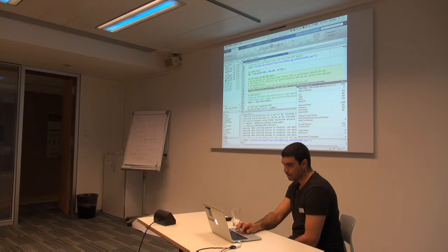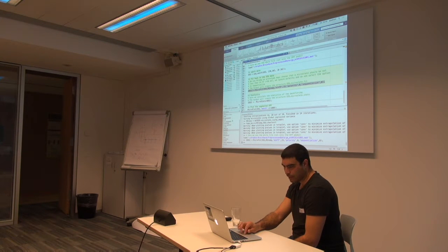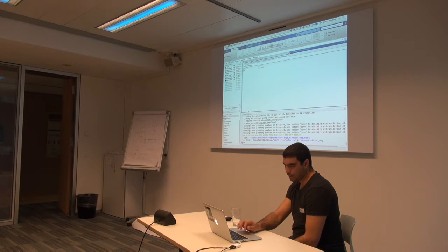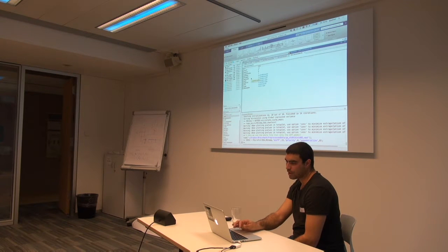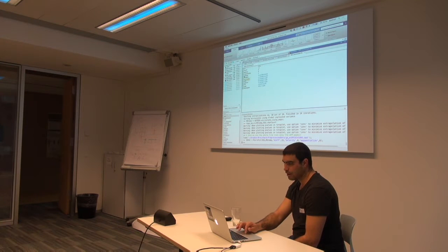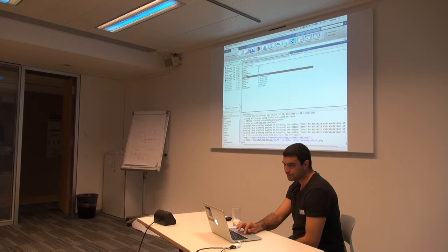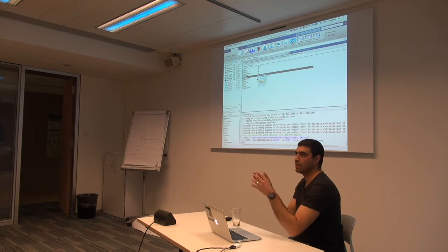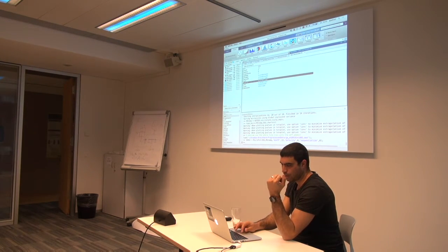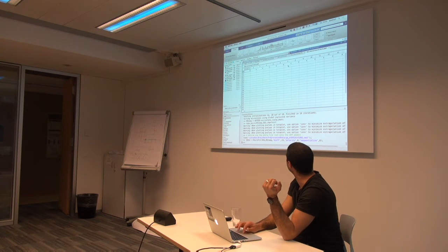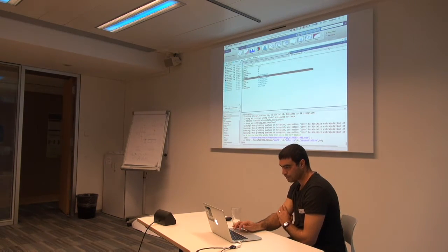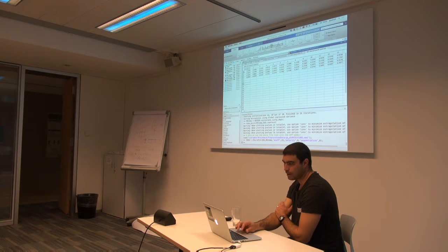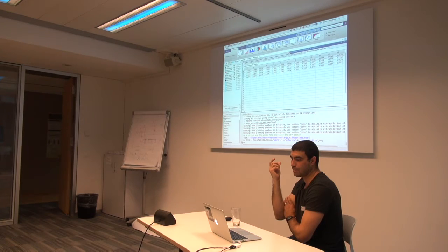We run the backfitting. Now if we go to EEG.microstate, we have a new structure called fit. In this structure, we have information about the function options and the labels — for each time frame, which prototype it belongs to. We get the best label over time; for example, it starts with microstate four, then changes to microstate three, and so on over the whole time course of EEG. We also have the spatial correlation between the microstate maps and the time frames, which we can use for statistics.